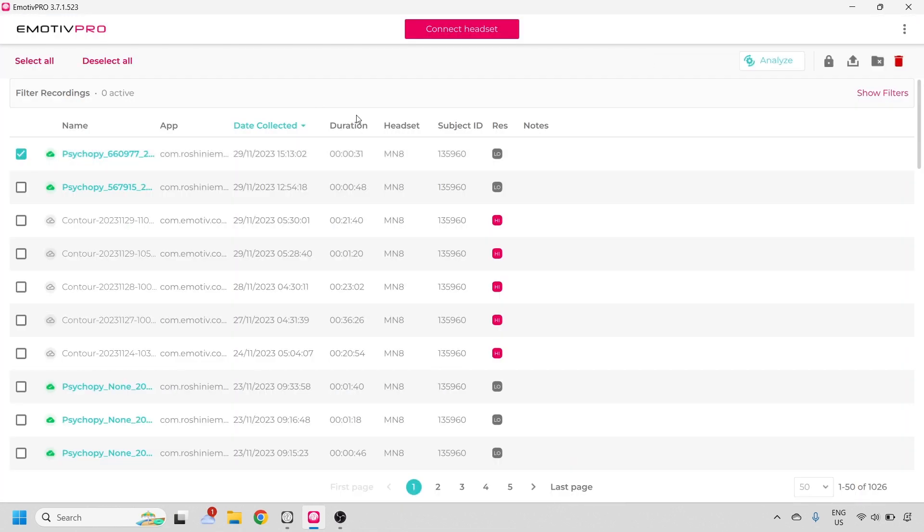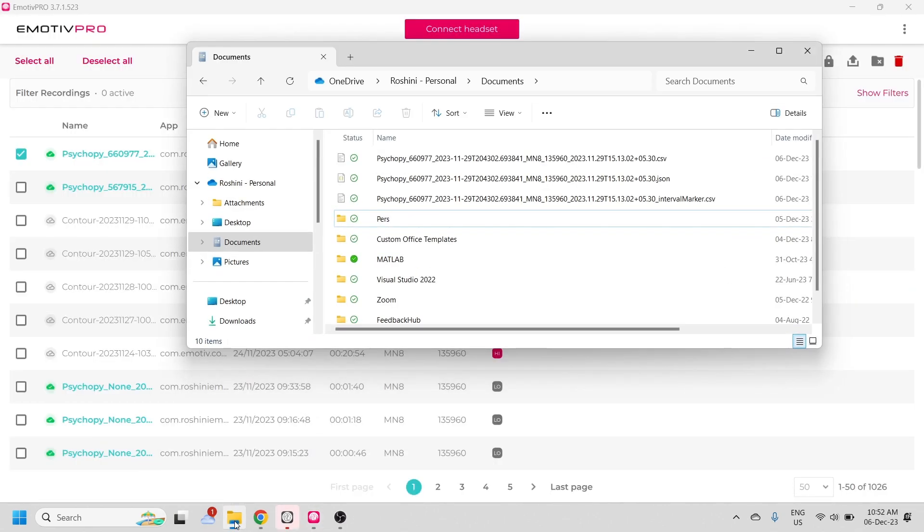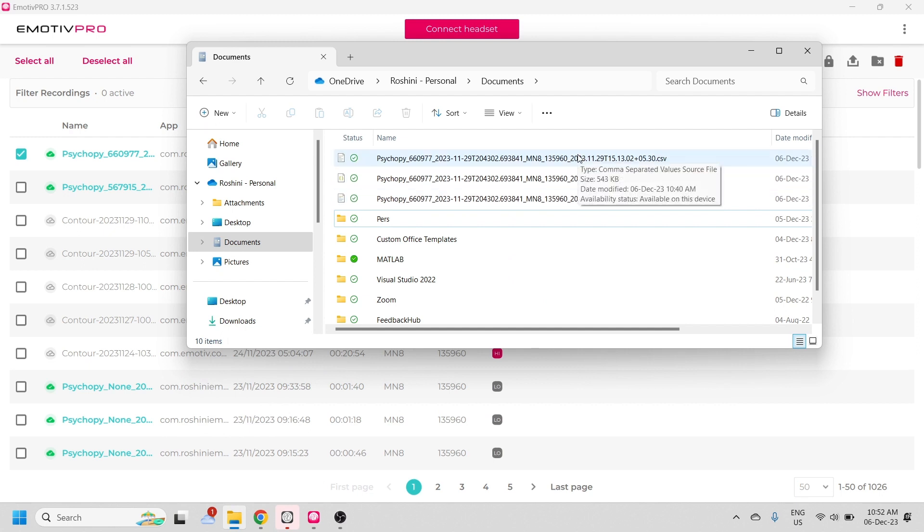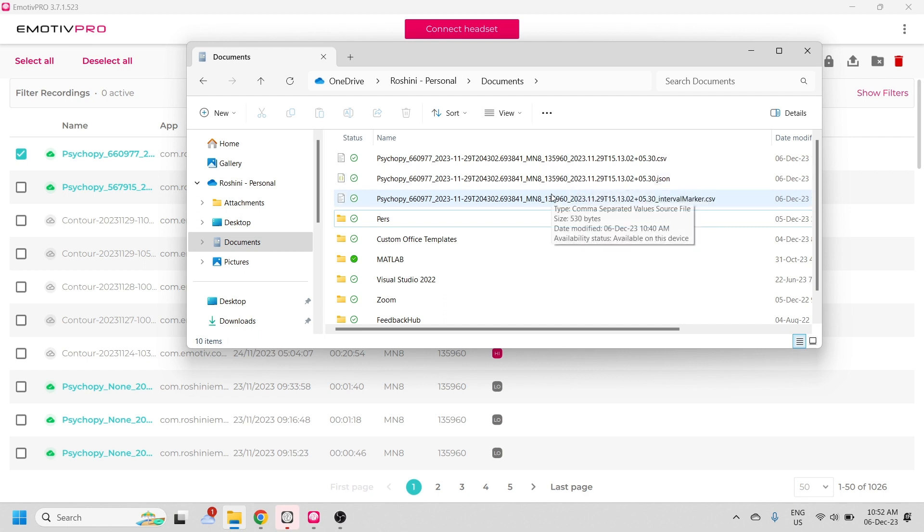You can send your data to Analyze using our Emotive Pro Analyzer ERP pipeline, or you can export the data. You'll see three files exported. The first is a .csv file which contains the raw EEG data with timestamps. The next is a .json file which contains some metadata. And finally the interval marker file where you'll find details of your markers with duration and time.